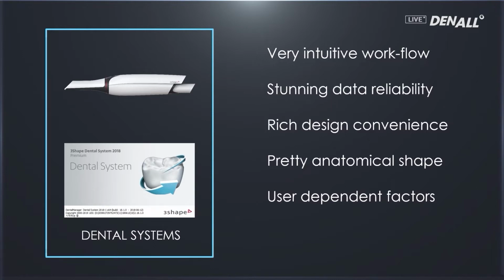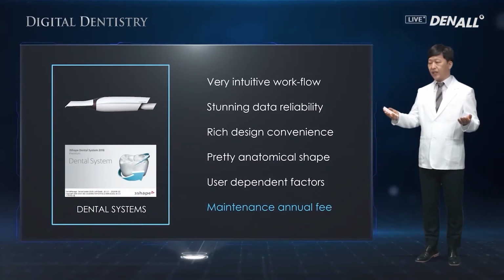In a dental clinic, when we have many different cases in terms of difficulty, intuitive programs like TRIOS may fit better. One disadvantage of that is that it requires a maintenance annual fee. Over time, I realize it's worth it.